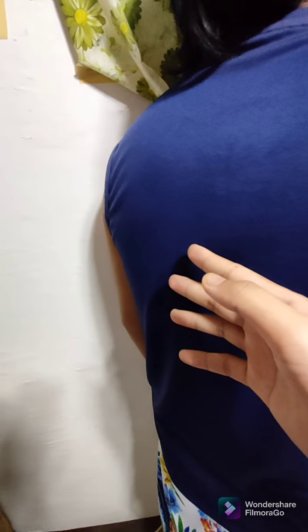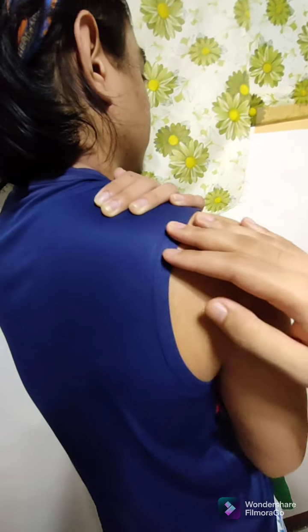Then there are two variations or different kinds of positions dito sa projection na ito. So, one is for the lateral body of the scapula, and the other is used for visualizing the acromion or the coracoid process. So, ganito siya. So, if lateral lang scapula ang hanap natin, have the patient grasp the superior portion dito banda sa chest niya. So, this position best demonstrates the body of the scapula. Kikita mo sa radiograph.